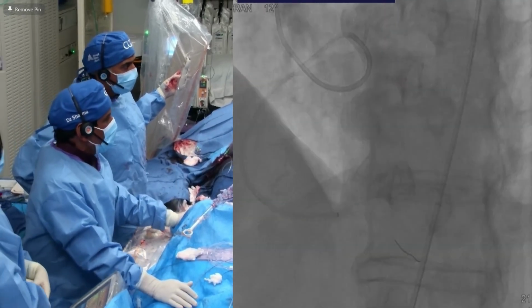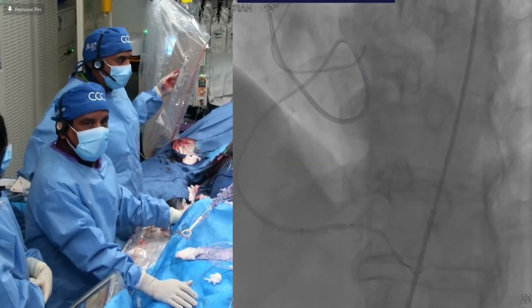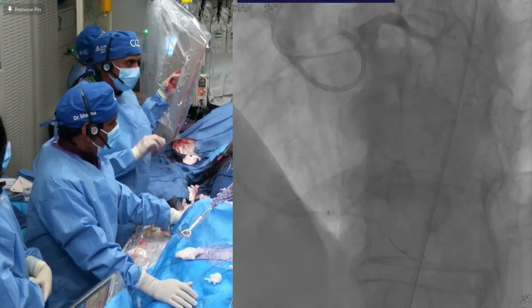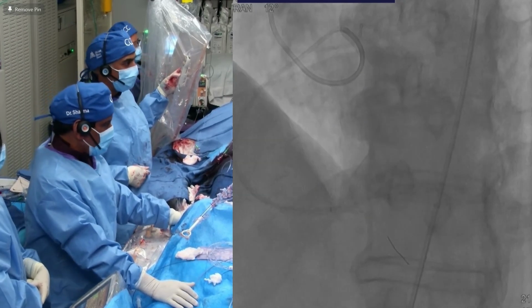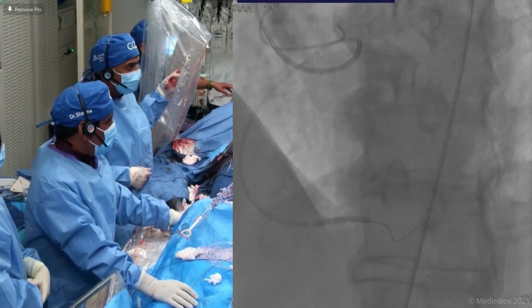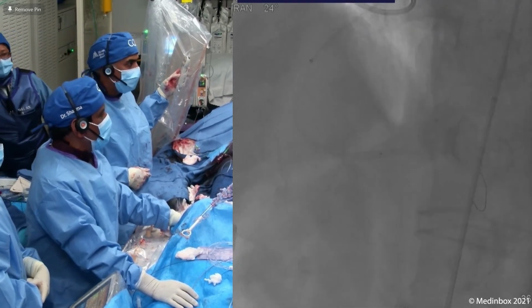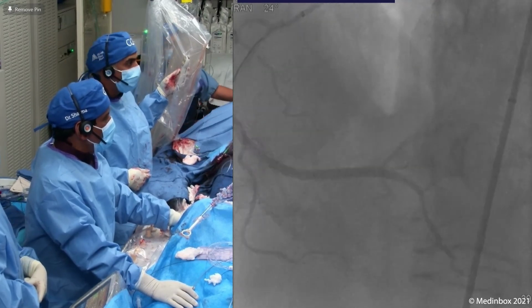As you can see here, we have put in 1 stent. I'm now going with the laser, with the contrast, right here. Look at that. Even after bringing the Godzilla down there, we couldn't pass that junction right before the AV continuation. Ultimately we did. And now we put in one stent, post-dilated. Let's show you the last picture. And we are done, and you can go on your break and get the next case ready.